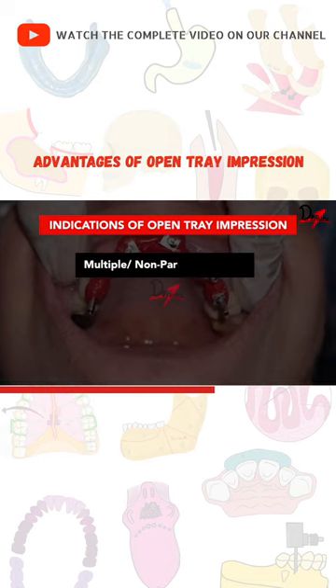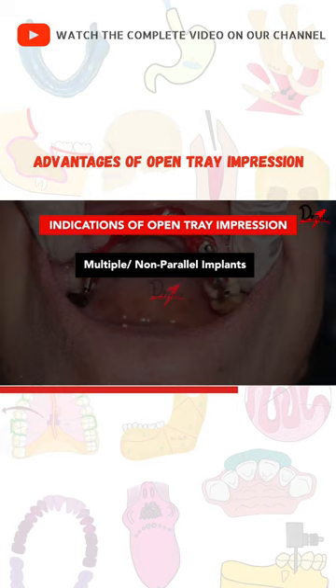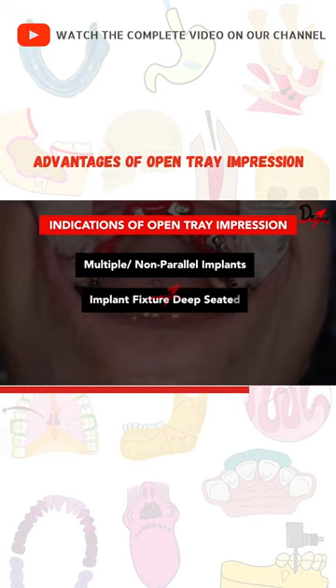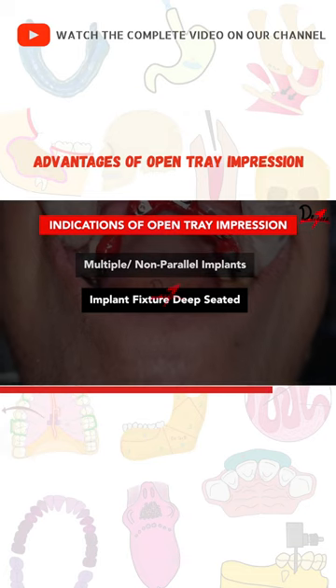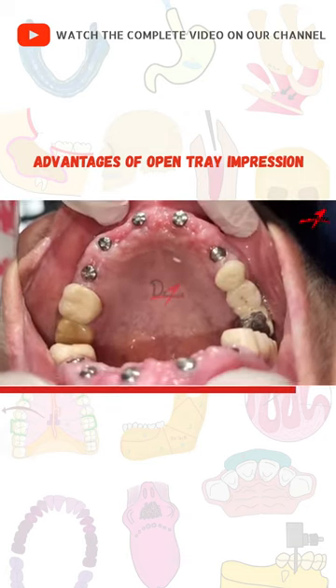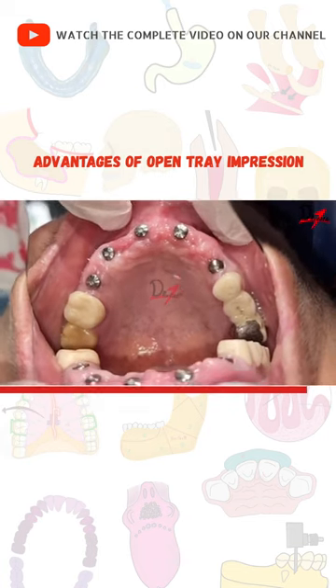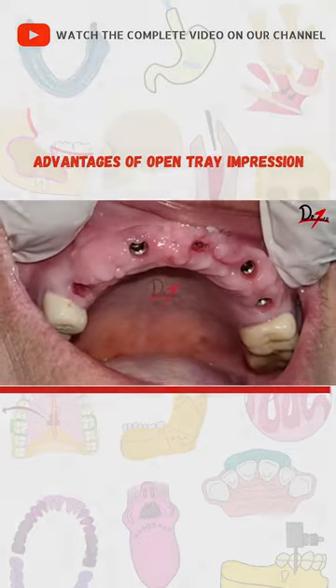The first indication is multiple implants, especially if they are non-parallel. It is also indicated when the implant fixture is deep-seated within the soft tissue. Let's begin the demonstration — here we have the gingival formers that we are going to remove, as you can see.